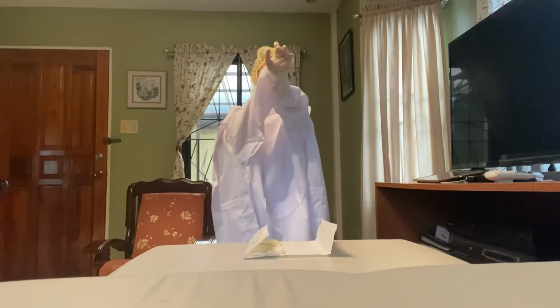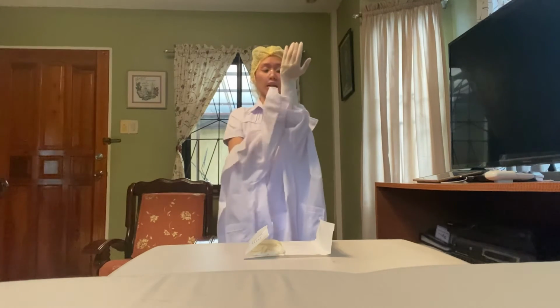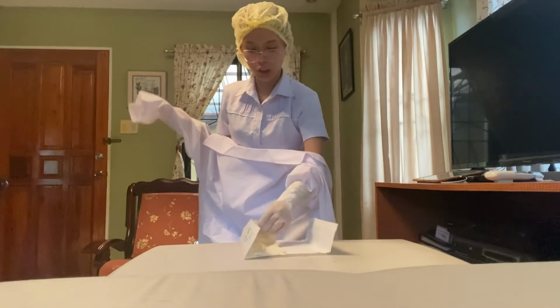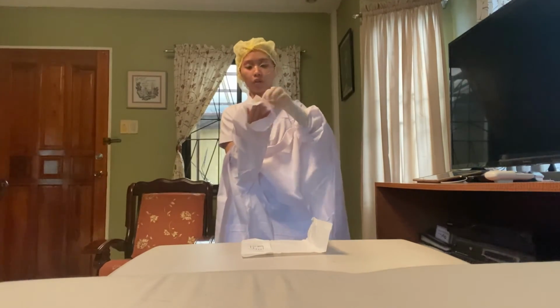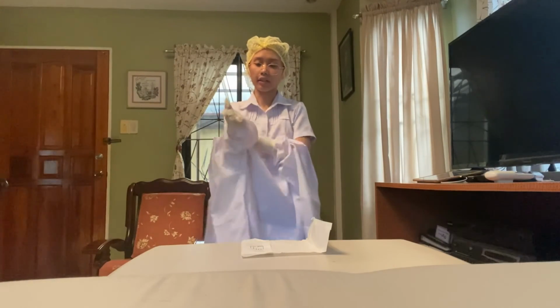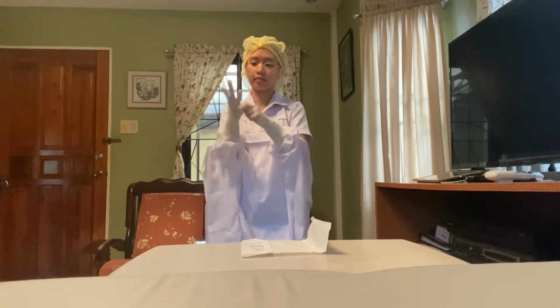Next, we're going to repeat the same steps. So we will pick up the right glove using my left hand. And then again, make sure that the right thumb touches the right thumb of the glove. So slide your hand all the way in. So I can touch the gloves since this is sterile. And then, adjust your gloves, your gown afterwards.